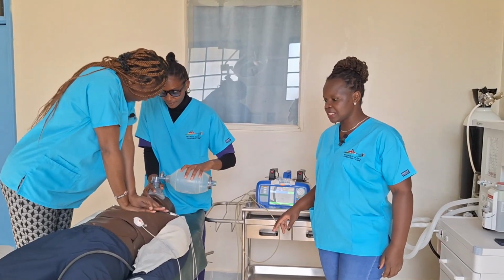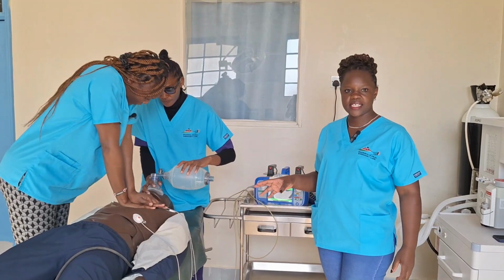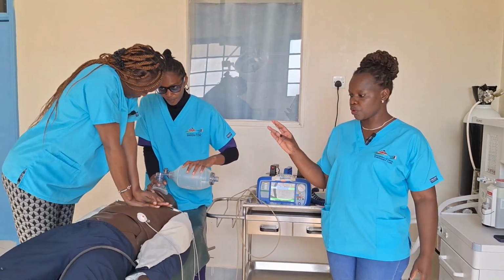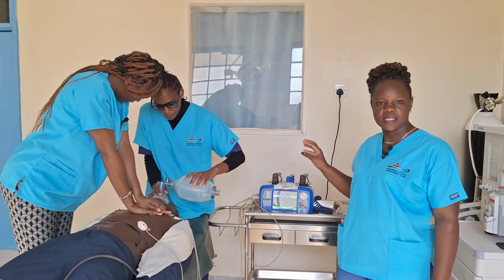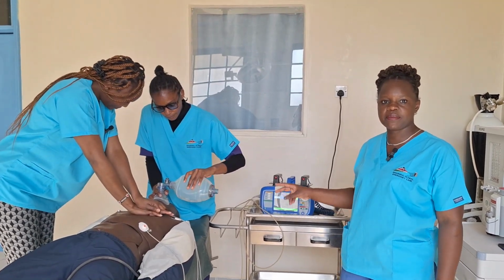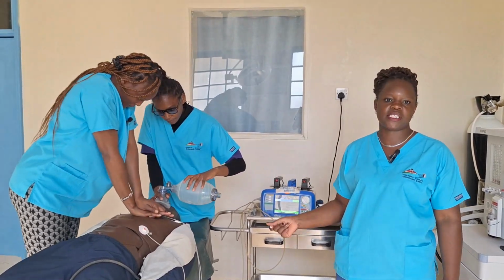The first priority in managing a patient in cardiac arrest is to connect the leads on the patient and identify the rhythm. If it's a shockable rhythm, deliver the shock immediately. That was a demonstration on how to manage a patient in cardiac arrest.